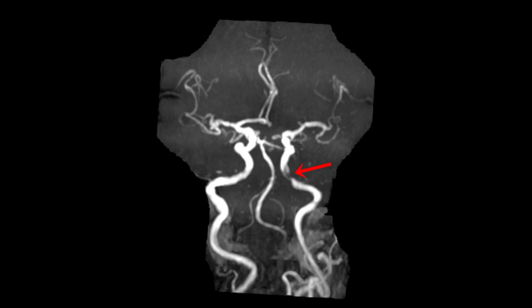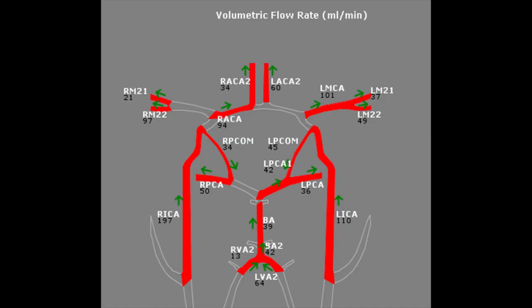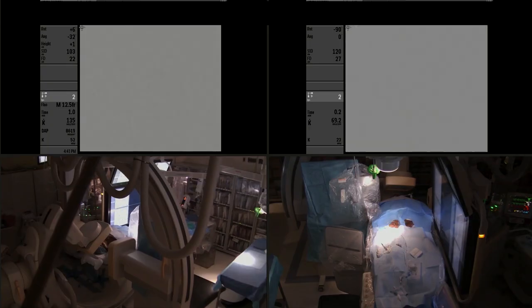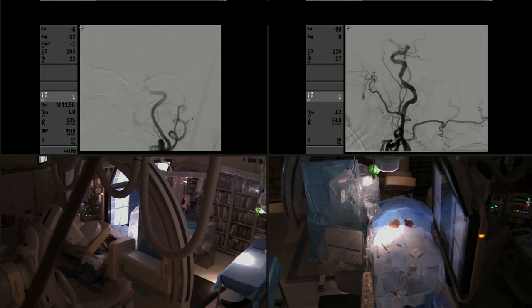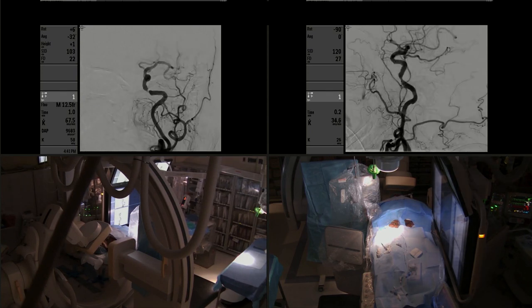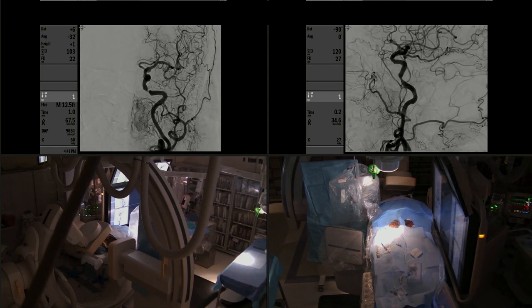You can see here the severe stenosis, and the NOVA blood flow study demonstrated compromised flow in the left hemisphere. She had failed medical therapy, so she was a candidate for stenting and revascularization.